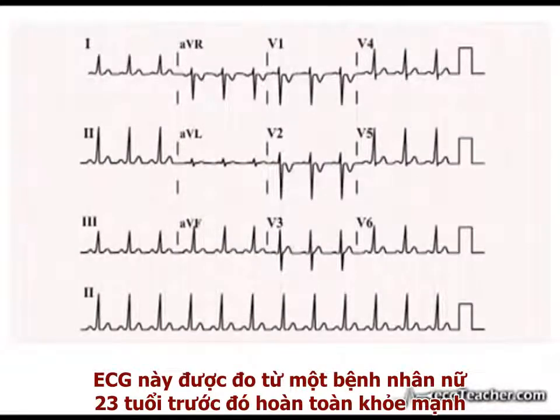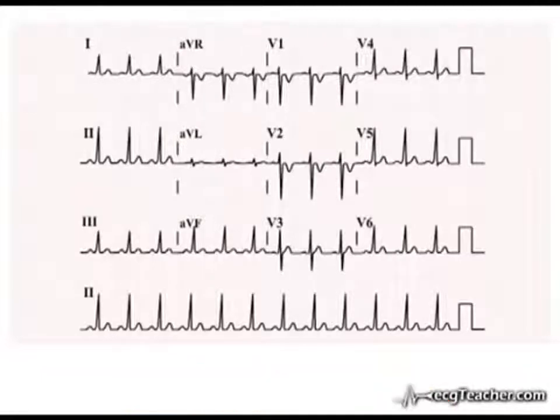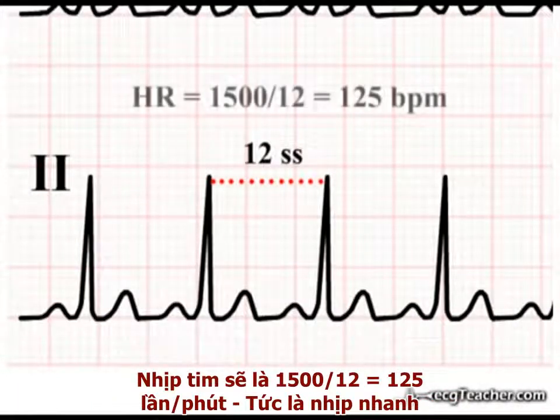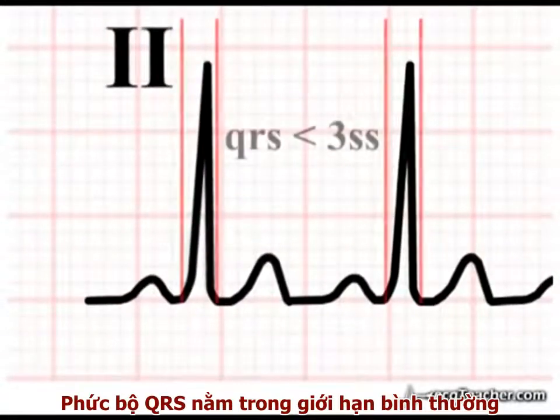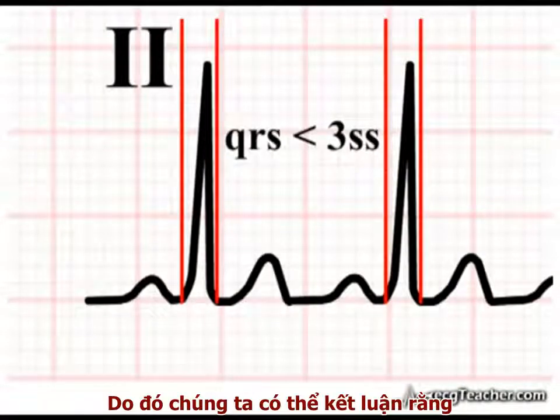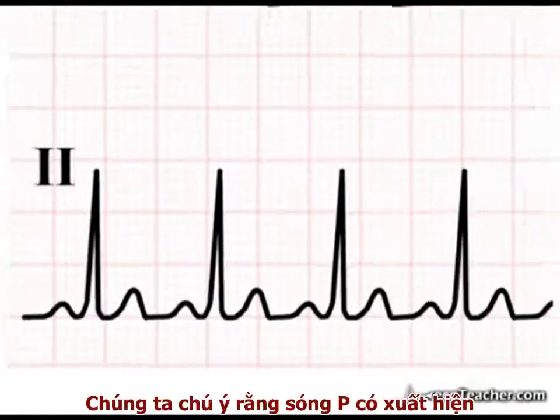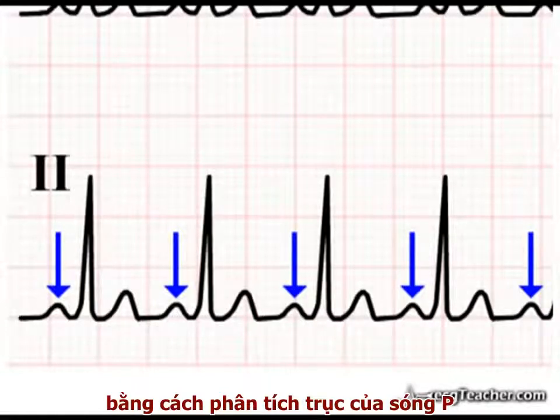This ECG is taken from a previously healthy 23-year-old lady who presents with a pyrexia of 40 degrees Celsius secondary to pyelonephritis. The heart rhythm is regular and there are 12 small squares between R waves, so the heart rate is 125 beats per minute — a tachycardia. The QRS complexes are of normal duration, less than 3 small squares in width, indicating that the depolarisation wave is entering the ventricular conducting system. Therefore, we can conclude that the tachycardia has originated from a focus located above the bifurcation of the bundle of His. P waves are present and we can identify the site of origin within the supraventricular region by analysis of the P wave axis and PR interval.